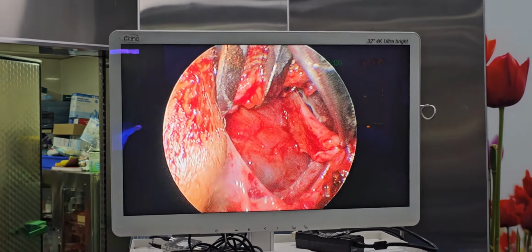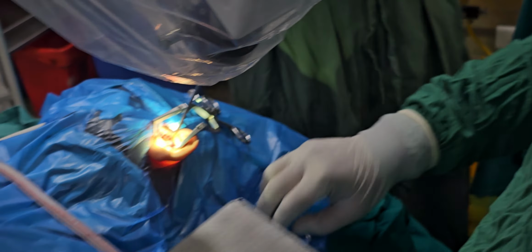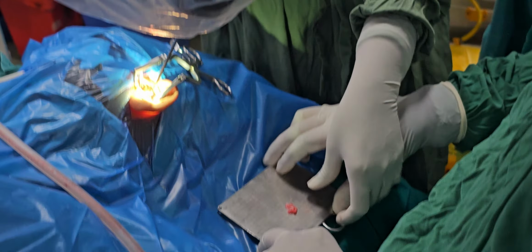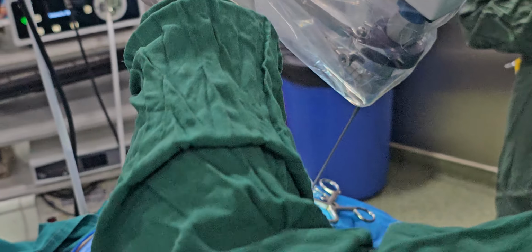Cavity is as good as not infected. So they use a fat or muscle.